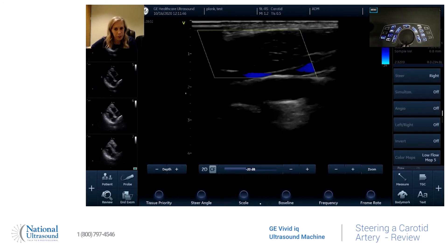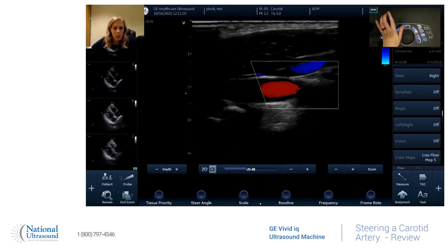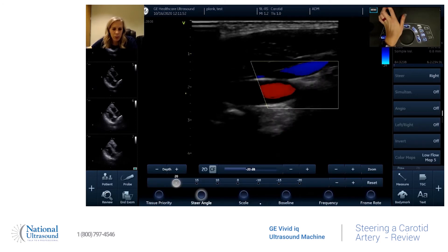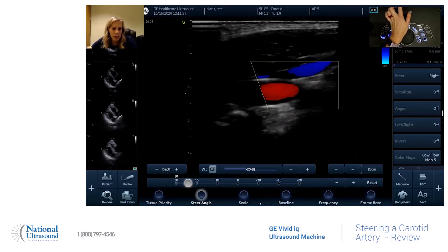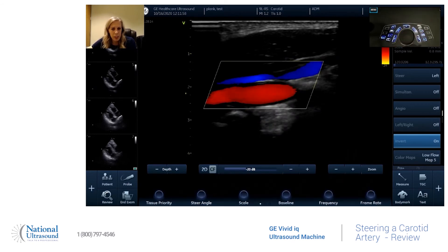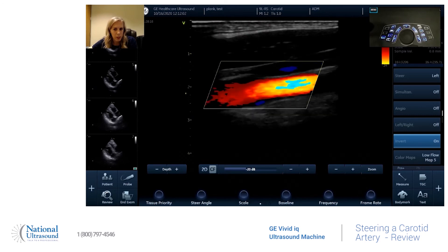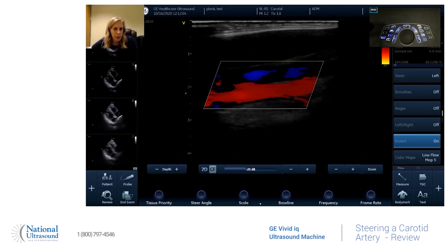You're going to press color, and as you can see it's steered the wrong way, so you'll hit steer angle. It's at 20 — you're going to move it all the way down to the right to negative 20, and now you see that the color is parallel with the vessel.